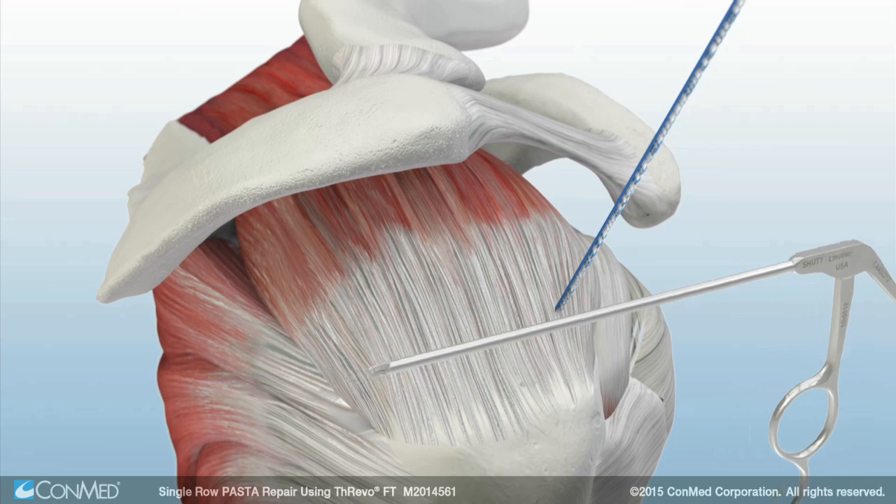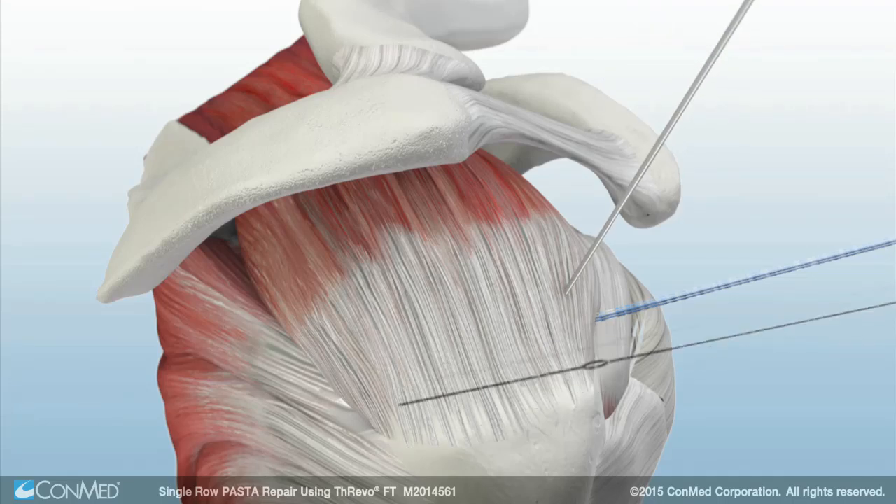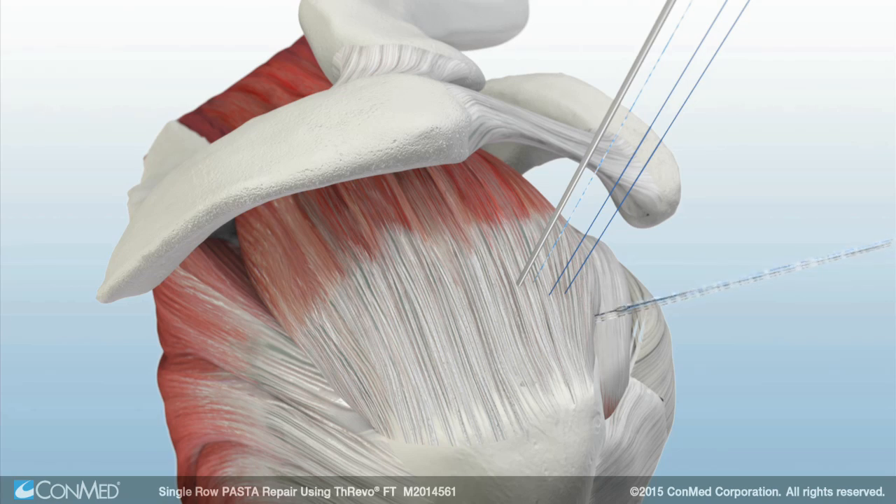A pair of suture retriever forceps are used to pull the sutures through the anterior portal. Starting with the anterior stitch, a spinal needle is passed through the tendon and the super shuttle is used to pass the first suture limb through the intact rotator cuff. This process is repeated for the other end of the first suture, then for all sutures working anteriorly to posteriorly until all sutures are passed.